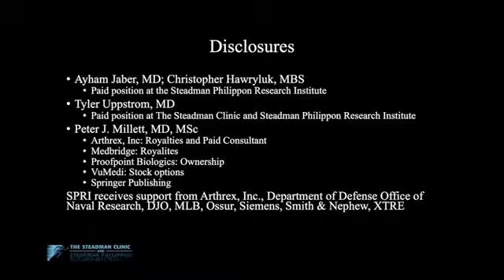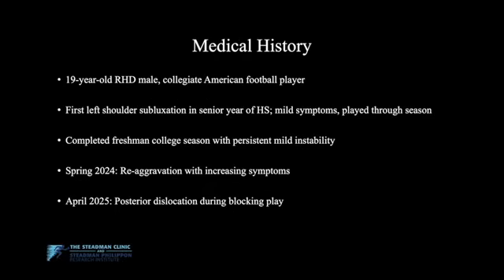In this technical note, we describe the posterior bony Bankart bridge technique for treating posterior bony Bankart lesions. The patient is a 19-year-old college football player with several year history of recurrent left posterior shoulder instability. Imaging demonstrated a posterior bony Bankart lesion with an associated glenoid cartilage defect and an anterior labral tear.